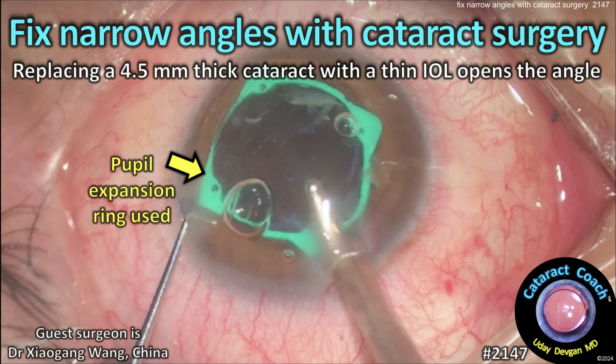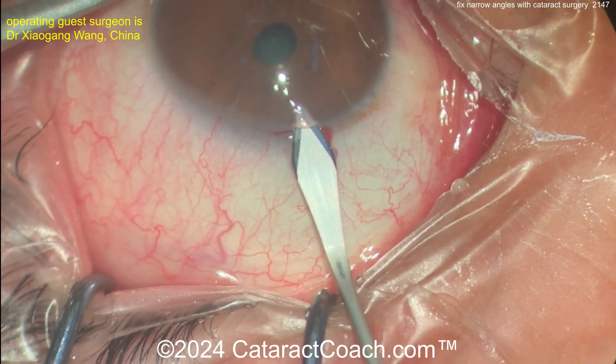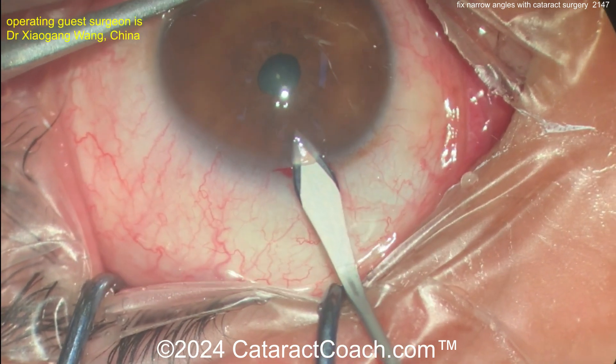From cataractcoach.com: fixing narrow angles with cataract surgery. When you replace a four-and-a-half millimeter thick cataract with a very thin IOL, you open up the angle. Our guest surgeon here is sitting superiorly.